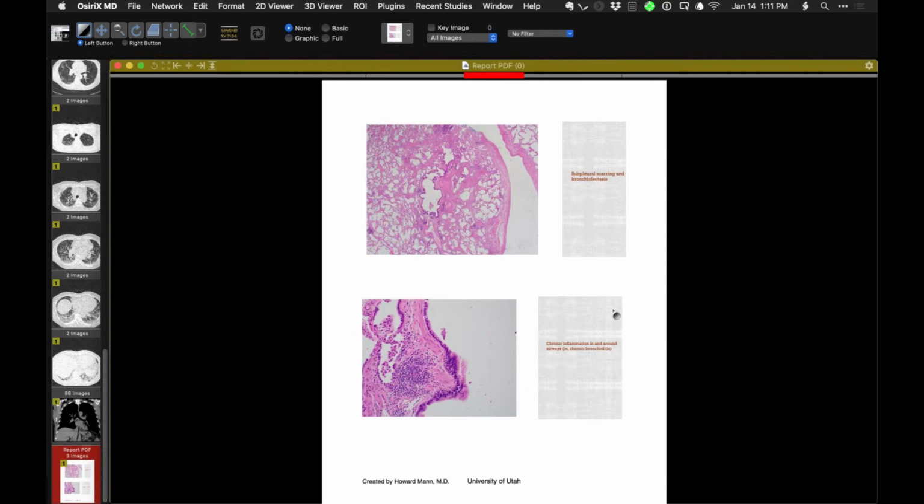Yeah, I think in terms of fibroblastic foci, if they are few in number and if they are more airway centric rather than at the leading edge between the areas of fibrosis and relatively normal lung, as in UIP, then they say that you can see those kind of fibroblastic foci in fibrotic HP. If I understand your question correctly, fibroblastic foci in fibrotic HP. Was there any known exposure in this patient? No. No, okay. No.